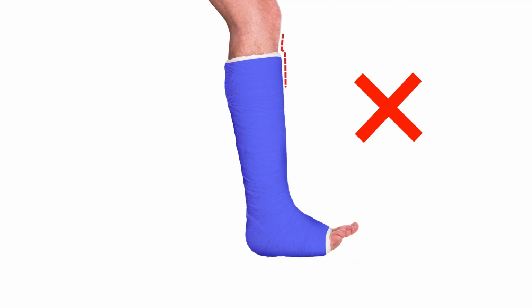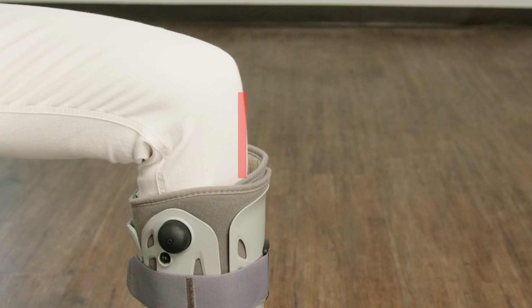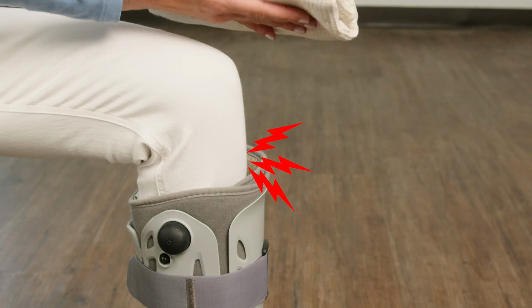If there's a large step between the end of the cast or boot and the patient's leg, then the area above the cast or boot is unsupported when you kneel on the crutch. This results in the patient's weight being concentrated at the top of the cast or boot, which can result in a painful hot spot directly under the top of the cast or boot. Fortunately, this is easy to fix.